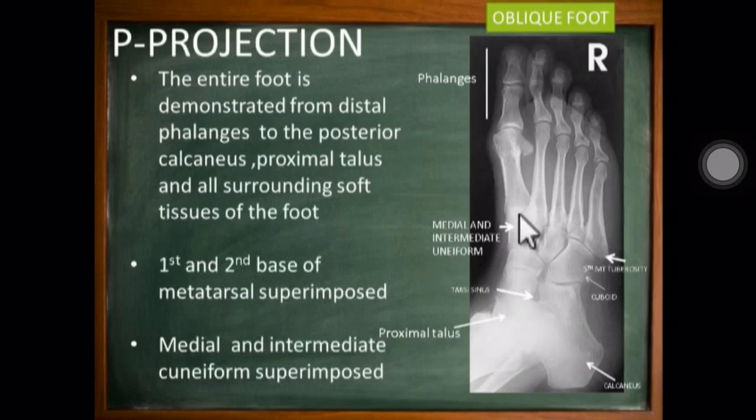This is the first base of metatarsal, and this is second base of metatarsal, and it is superimposed. And the medial and intermediate cuneiform are superimposed.